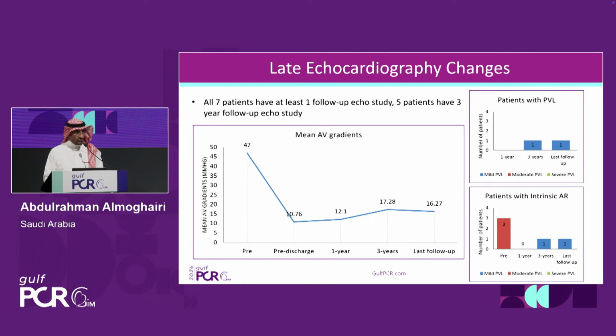No patient was admitted with cardiac-related symptoms, and these are their echo results. It's a sustainable result over the last 5 years so far. And we will probably continue to follow the rest of the patients and report the subsequent hemodynamics and echo findings in the future.